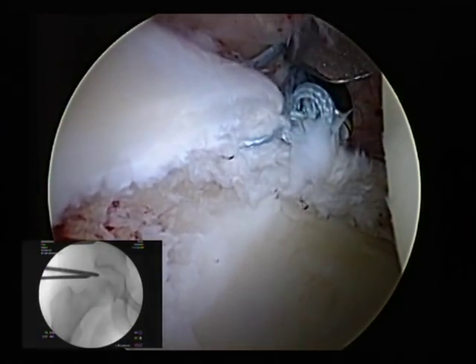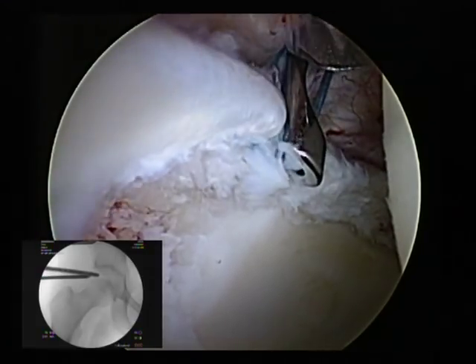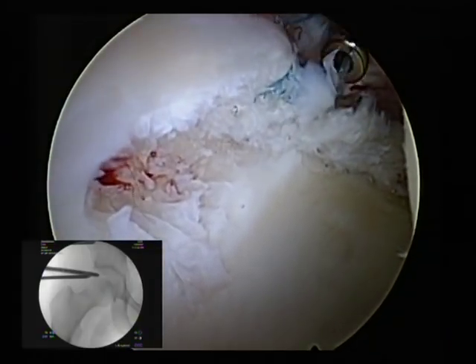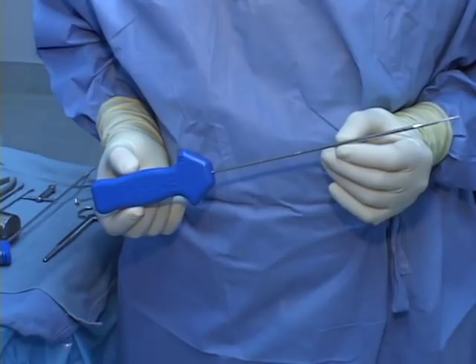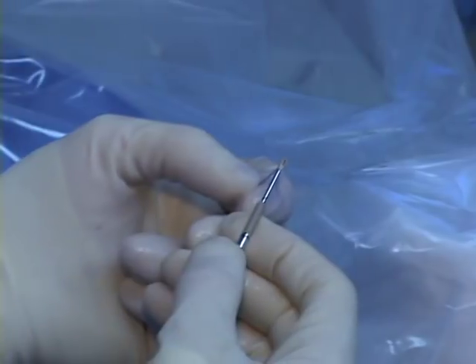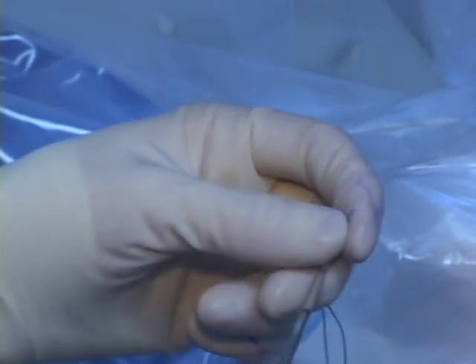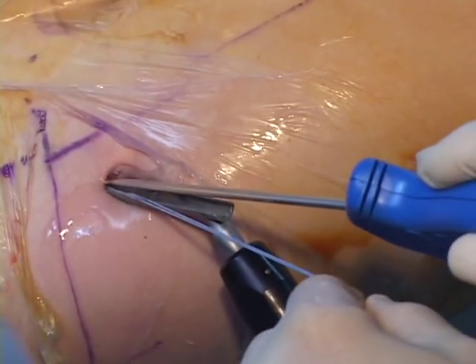Make sure to deliver it without too much trauma to the remaining labral tissue. Now we've got a nice solid piece of labrum here — we're going to be ready for anchor delivery. This is the 3.5 millimeter push lock anchor, which is a PEEK material. Now we've got our cinch stitch in place and the anchor is ready to go. One of the tricks here is to make sure that we don't have any kind of convolution. I'm going to deliver it into the joint and make sure that I know my angle of how I'm going to deliver this device.